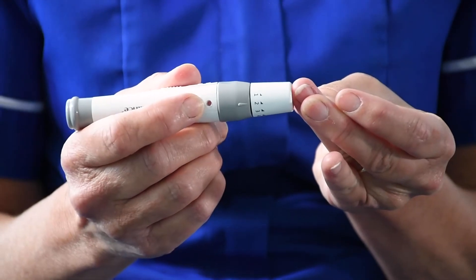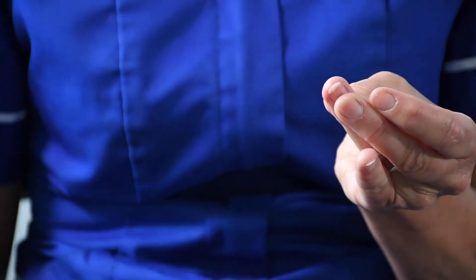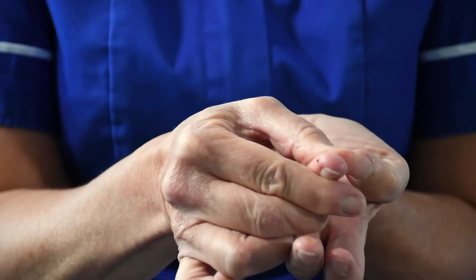So how do you take the blood sample? We take the blood from the tips of the fingers — it's good to take it from the sides of the tips. Bunch the finger up with your thumb. Take your finger pricker and place the end against the side of the finger. The finger pricker will have a button on the side — press that button and that will allow the needle to enter the finger. Take the finger pricker away and put it down.